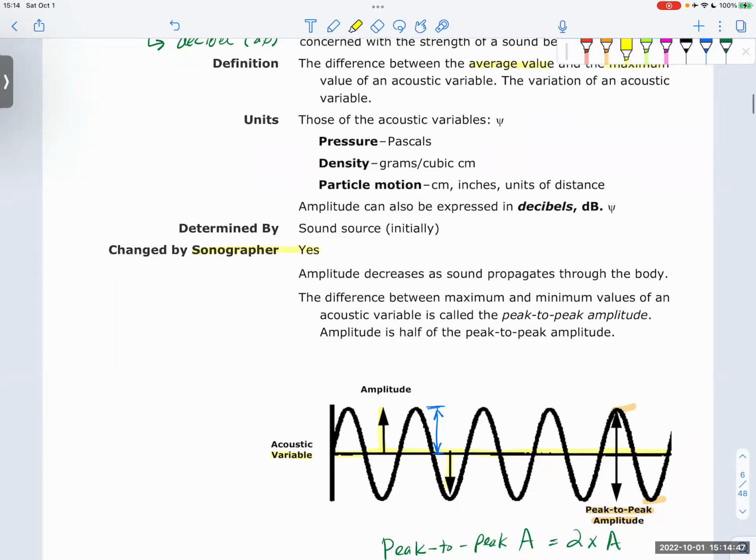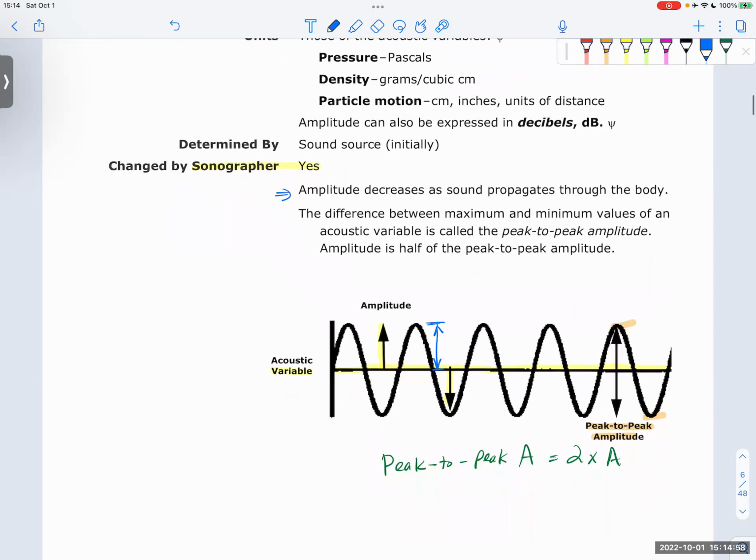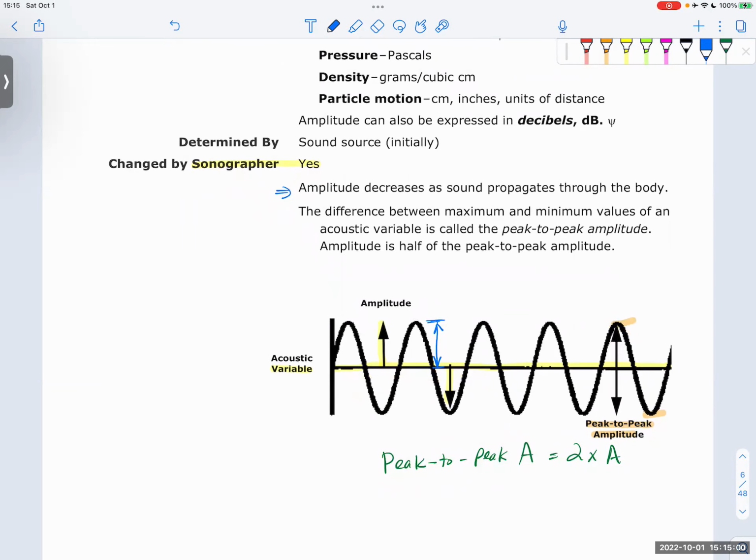Okay, now this sentence here we will come back to later, but I think it's simple to imagine what happens with the ultrasound wave when it passes through some tissue. Let's say this is the baseline here, and this is the body. The ultrasound starts with a high amplitude, this way. Now it's going through some tissue here. This is like the body tissue.